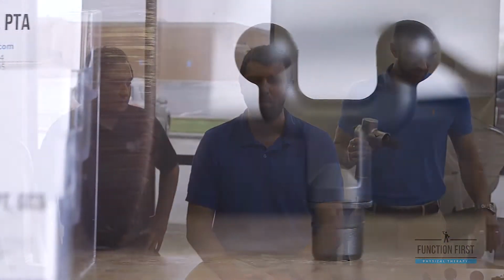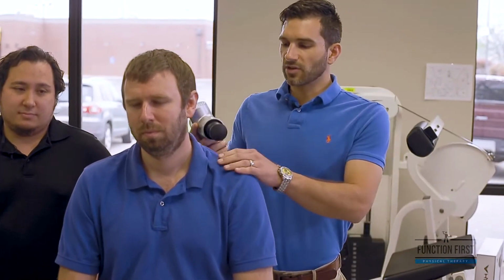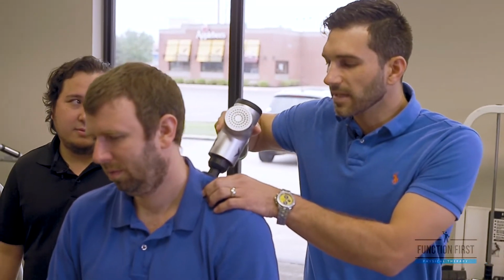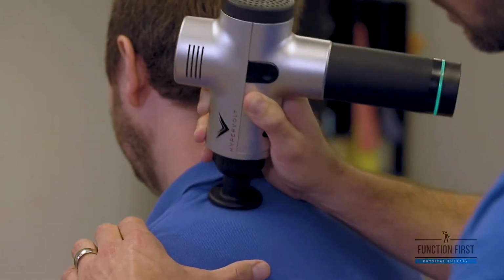Matt. How's it going? So we use the Hypervolt a lot in the clinic. So I'm going to be demonstrating it and what we use it for, and also some different heads that it comes with. So a lot of our patients, they come in, they have tight traps. So we can go to work right away, usually on level 1, flat head, on the traps. Spend a little time there just to start getting those to relax a little bit.